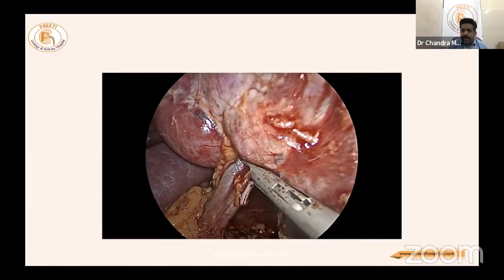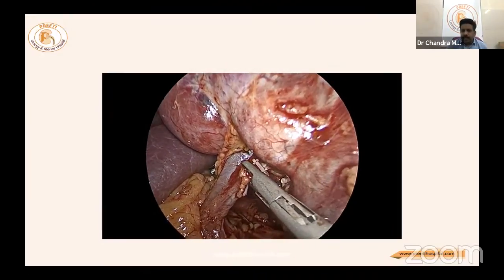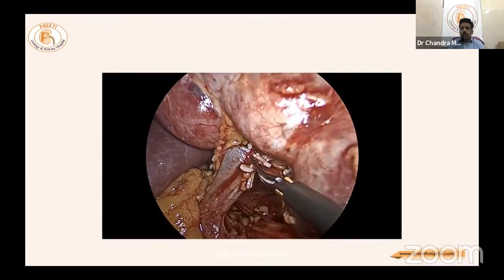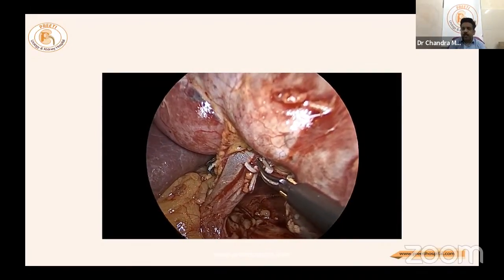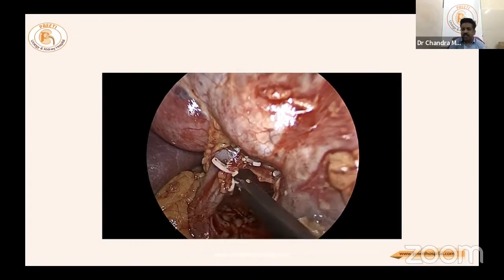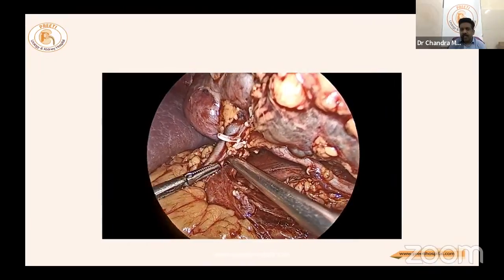Identify the structures carefully. Whatever is going to the lower pole can be clipped, which significantly reduces warm ischemia time. Initial clamping and dissection without this step has no value. Pre-clipping lower pole vessels before applying the main clamp is strongly recommended.